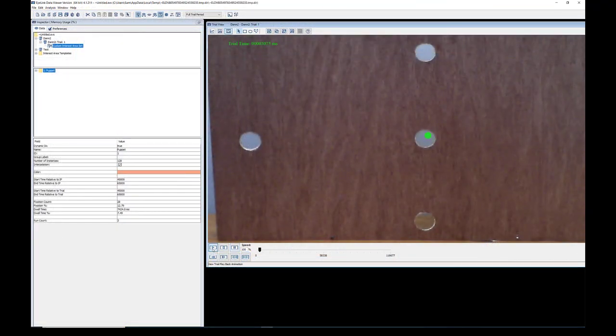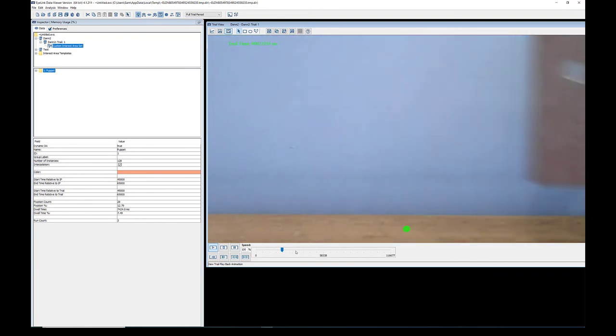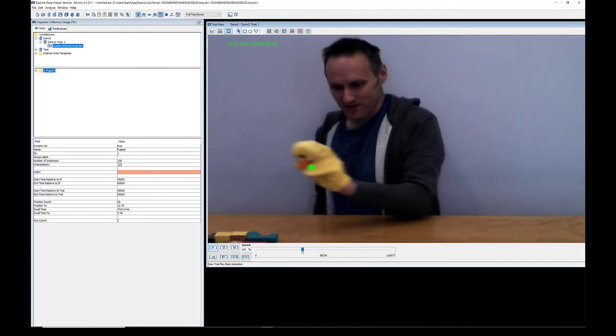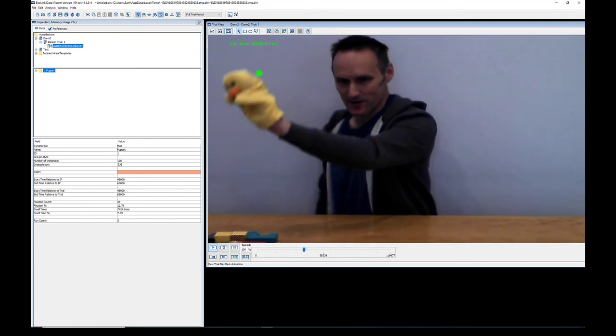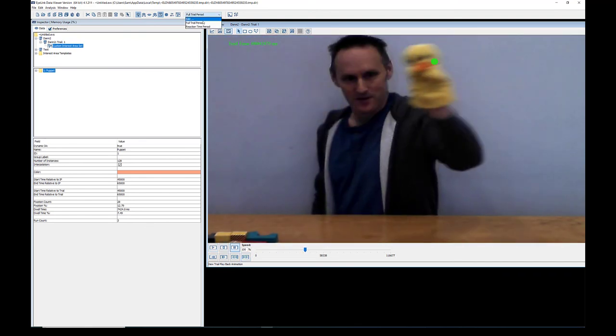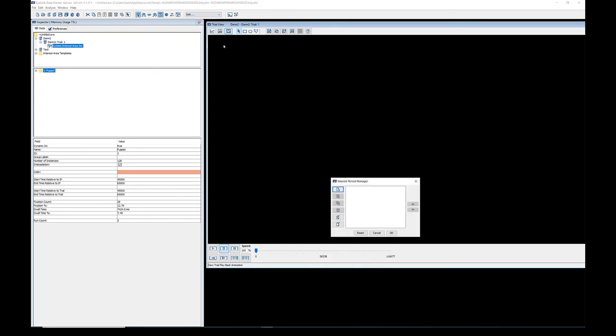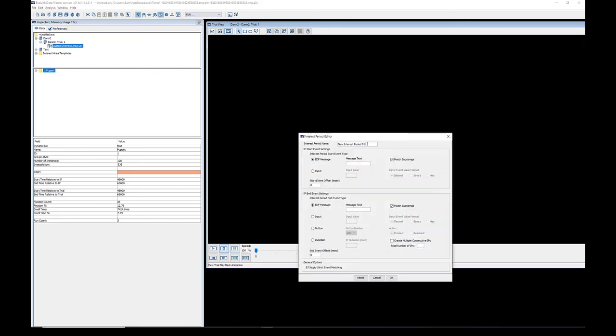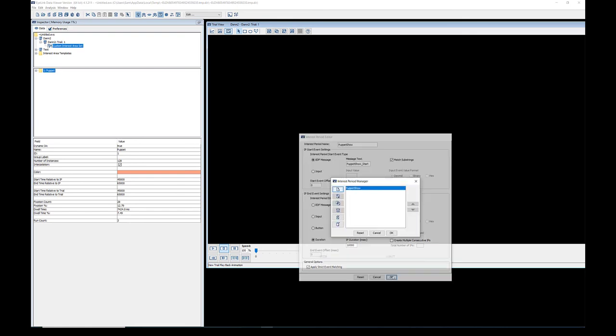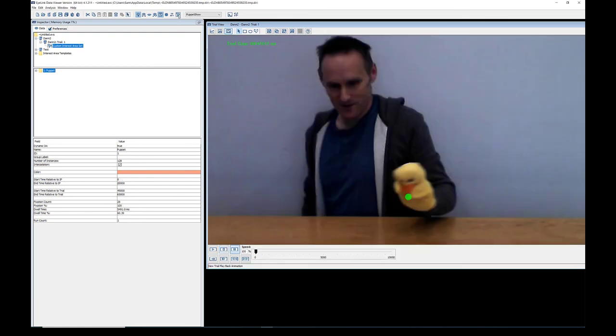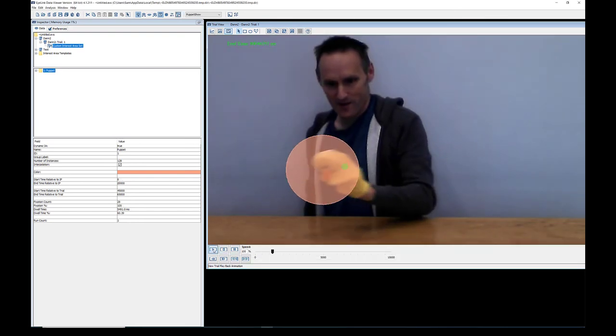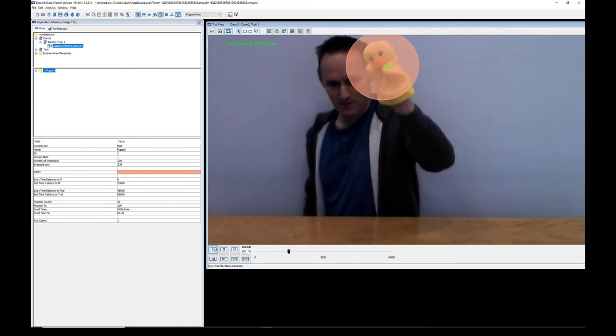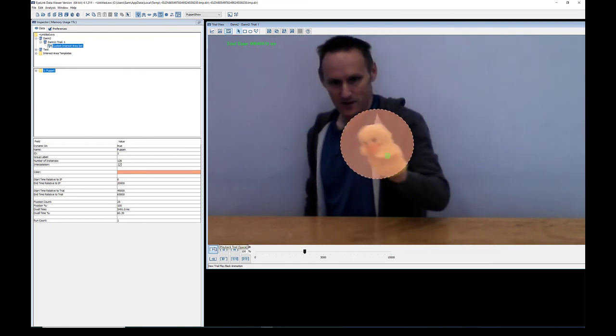The iLink data file can be opened in Data Viewer where you can playback the recording in the trial playback animation view. You can also create interest periods and static or dynamic interest areas just as you would with any other iLink recording.